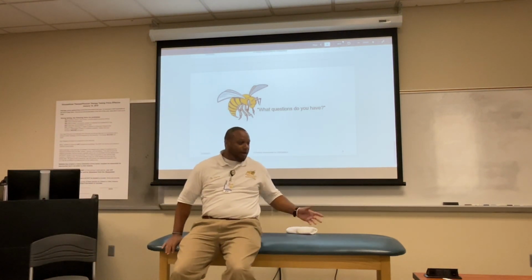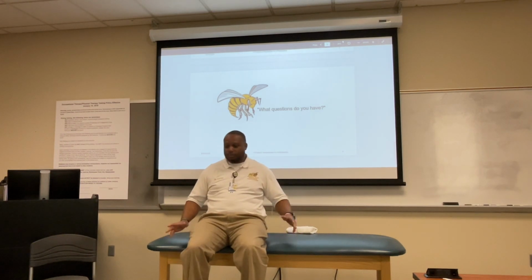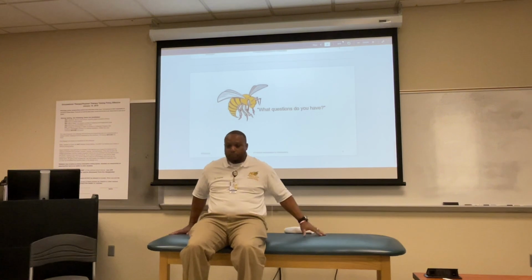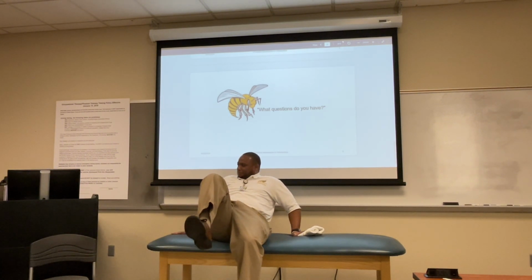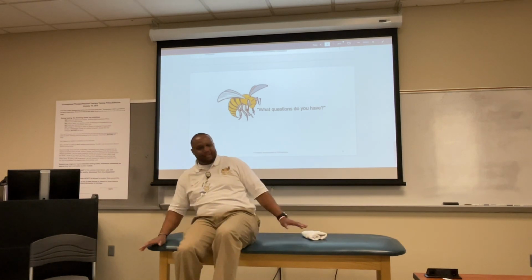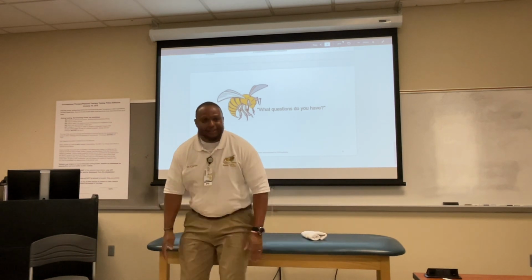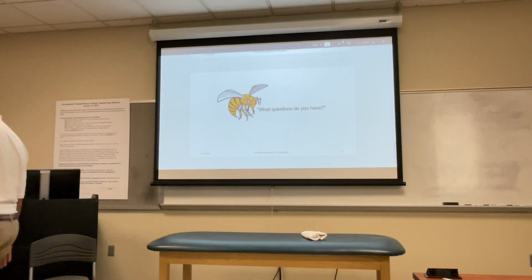If you're doing manual muscle testing, or even Goni, though most of the time Goni is done supine, I'm going to tell you all kinds of things they do. They lean back on you. They have all kinds of little tricks that they try to do to get more range of motion at a specific joint. All right.